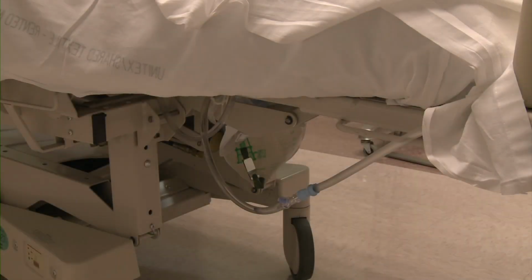You may notice various tubes or wires hanging from the underside of the bed. In this case, down by the foot of the bed, you see what looks like some drainage tubing running to the undercarriage of the bed. These tubes and wires are necessary to make the mannequin run. In this case, this is a drainage system for the IV system. This is not a Foley catheter.